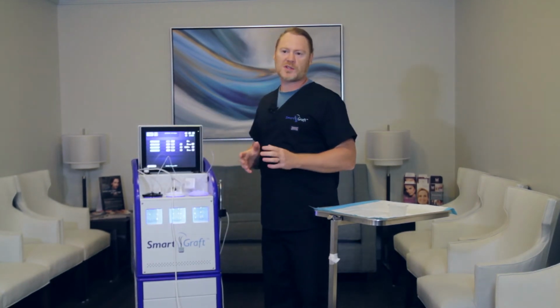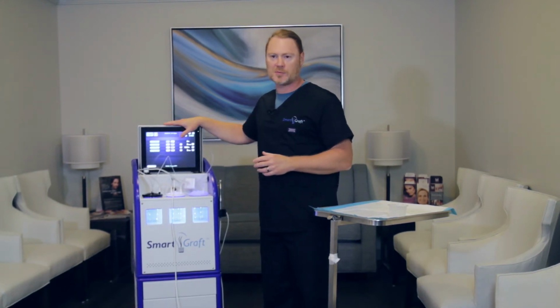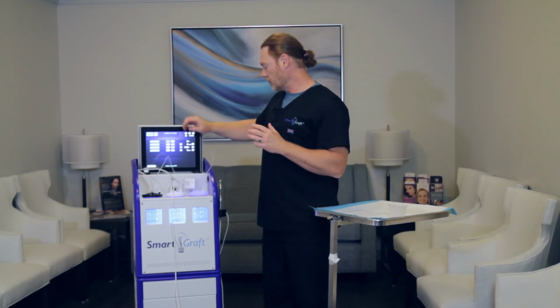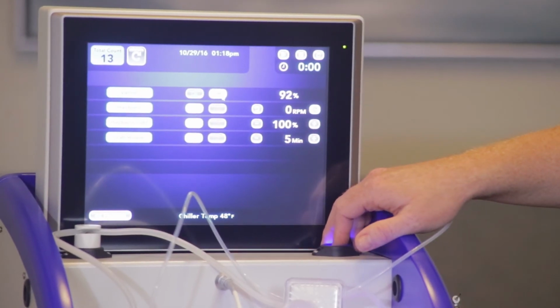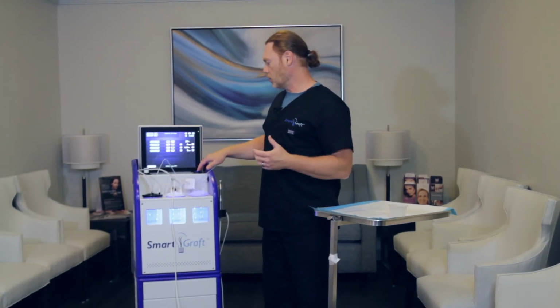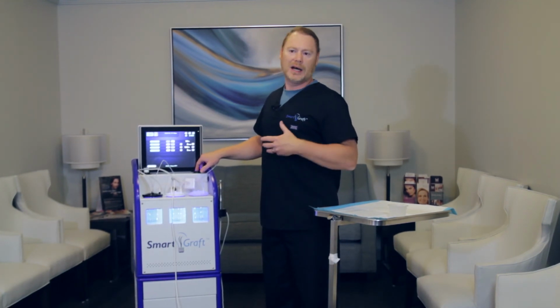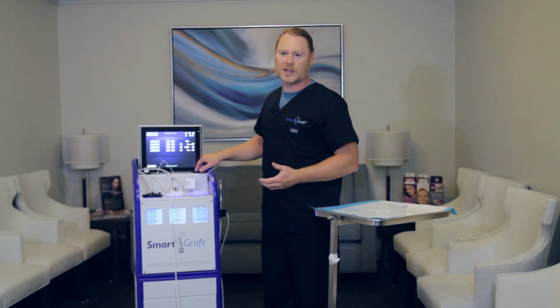There is actually one more switch on this device. It's a pretty cool button. In case that anything happens with the computer and the screen malfunctions, which I've never seen, there is an emergency button here that you can turn on. And basically what that allows is the vacuum to work and the handpiece to work. So it's actually still a functional device. You probably will lose control over all this, but you can definitely get through your case. It's just a safety measure that's been installed. Not really necessary, but we like to think of everything.